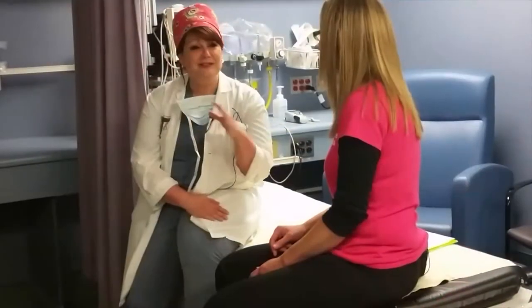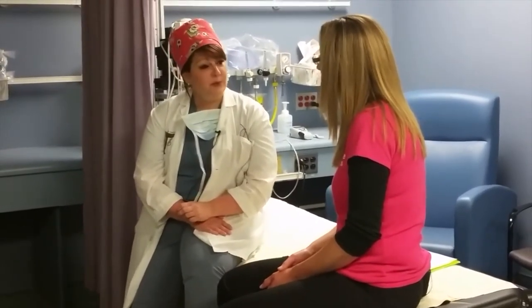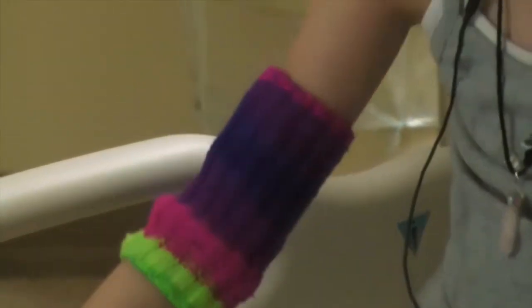Okay, this is a crazy question. One of the UPOP users sent in a question because they knew we were meeting with you today, and they said, are there pink and purple PICC lines? That's a great question, because if it were up to me, they'd be all different colors. Unfortunately, it's not. Most of our PICC lines are white. But we do actually have purple PICC lines, which are a very special PICC line called a power PICC, which can be used for CT scans. So they do come in purple, but it's not necessarily the case that you're going to get a purple one. We do, however, have volunteers that make beautiful knitted covers that go over our PICC lines that come in all different colors. So you can certainly make it very specialized to what you like.